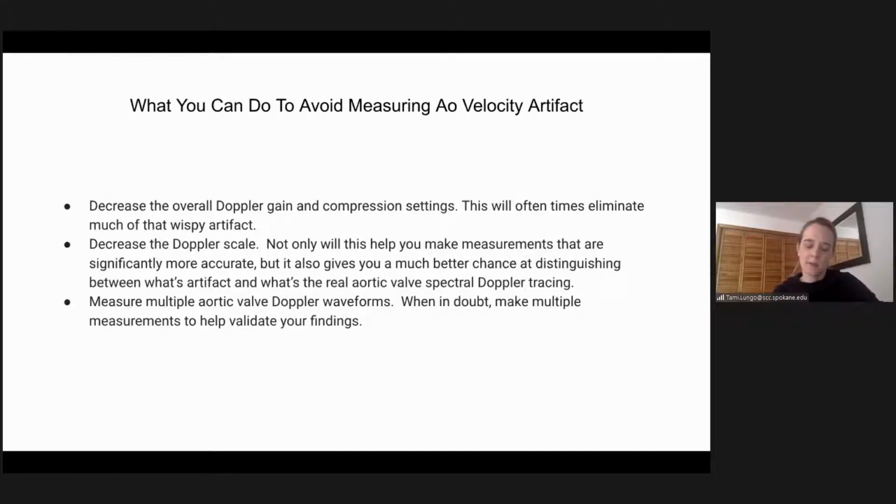Okay. So that's why it's really important to gain that down. A lot of times, when it does come down to that, they take the patient to the cath lab. We as echo techs seem to overestimate a lot of times because we like to incorporate so much, and we almost seem to want it more severe than it is. So the cath lab always tells us, you guys overestimate. So just make sure not to incorporate all that wispy stuff.